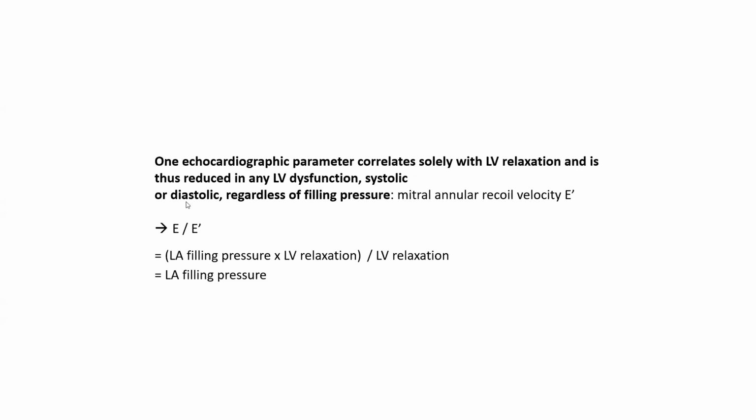Now I will move on to define that E to E prime ratio. And I very much like this equation. I see a lot of fellows not knowing why E to E prime corresponds to LA pressure. E to E prime is actually the purest definition of LA pressure. And why is that? You can plug in this equation. We said that E is dependent on LA pressure and LV relaxation. So E is LA pressure times LV relaxation, whereas E prime is purely dependent on LV relaxation.